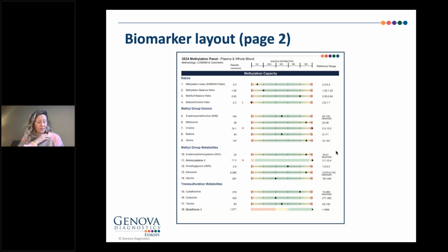Just some very obvious information here. Biomarkers that are outside the reference range will appear under their corresponding pillar on the first page. The biomarkers that are listed as either too high or too low are the ones that are on the first page in the pillars on the first half of that page. You will see them with a corresponding triangle pointing either upwards or downwards, in yellow or red, depending on how far outside of the reference range they are.